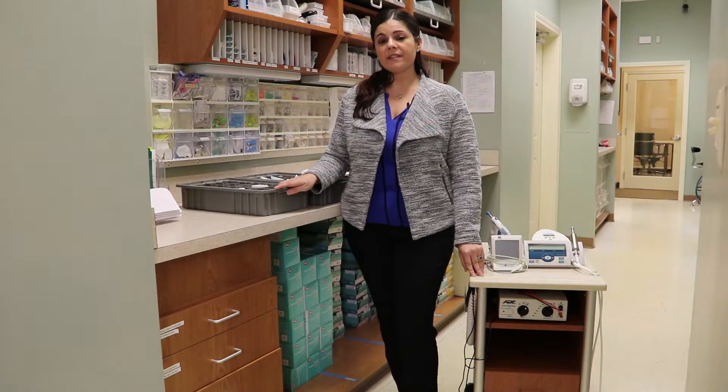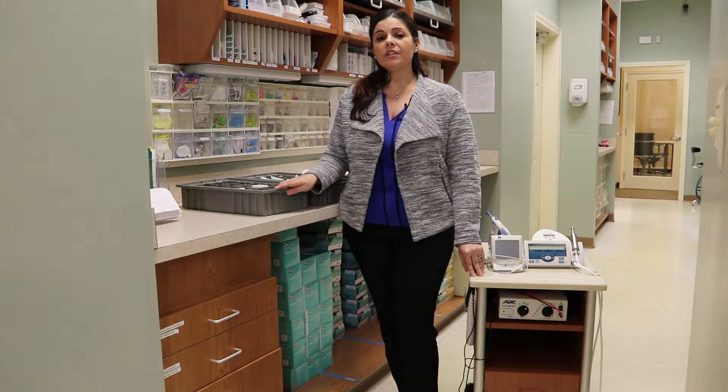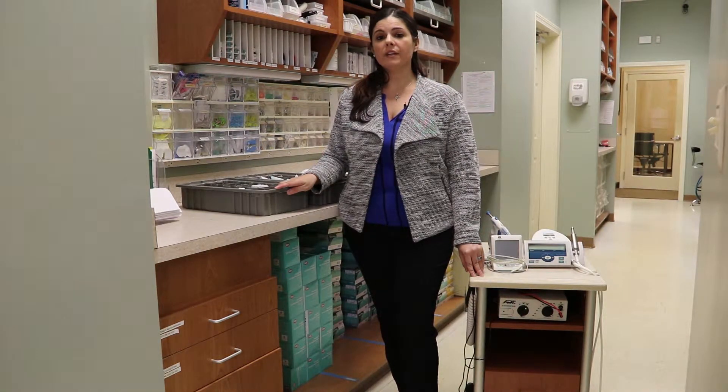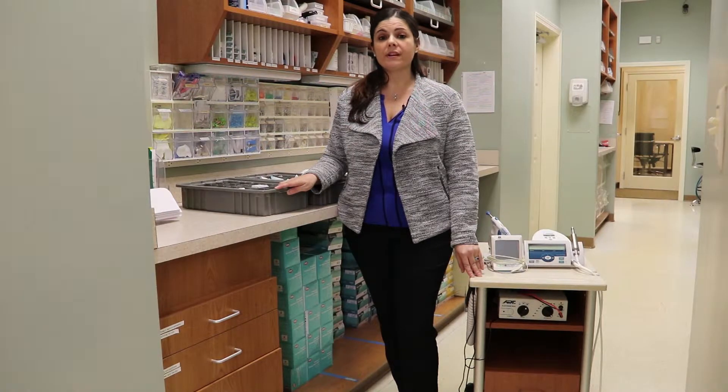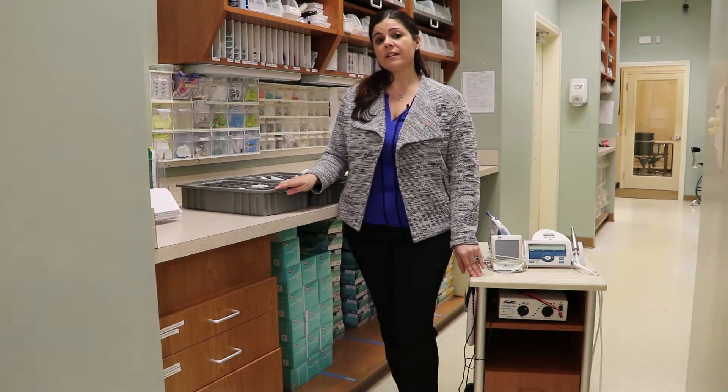Today we'll be focusing on setting up for an endodontic procedure. Root canals are not always predictable — you can have a crown in your chair that quickly turns into a root canal. This is a great opportunity to incorporate some same-day care if you don't move the patient and you don't stress the team out. Let me show you how it's done.